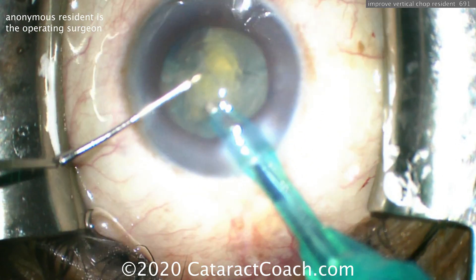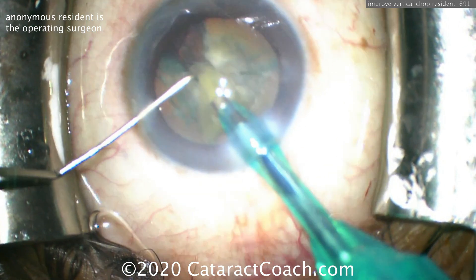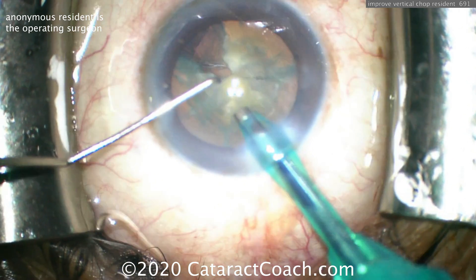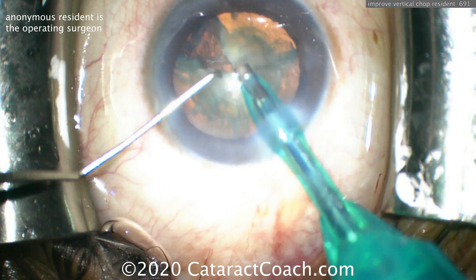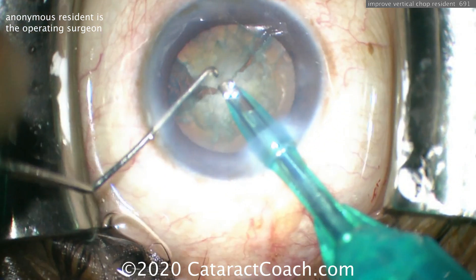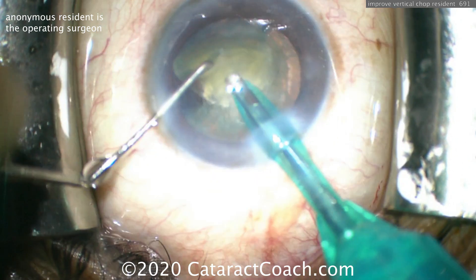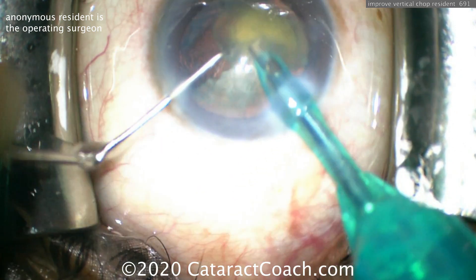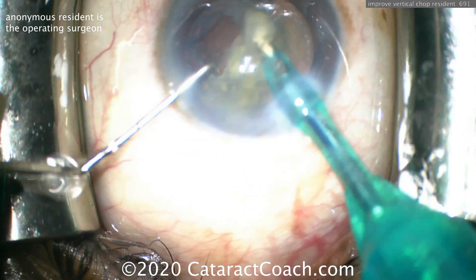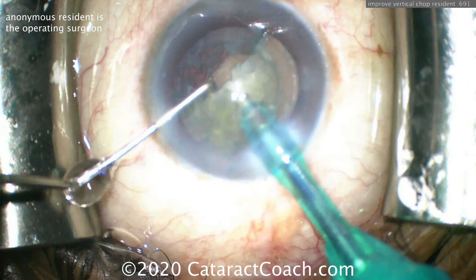Keep in mind that sometimes you need more than one chop to really get it propagating all the way through. In an eye like this, taking out a quadrant first is very helpful because it gives you a little bit more working space. One thing to watch out for is look at the post-occlusion surge — look at the iris and see what happens after the nuclear material clears the phaco tip. You'll see a bounce in the iris. Buzzing in with the probe here, taking the piece down, and when the tip gets opened you'll see a surge of fluid and that bounce sign on the iris.